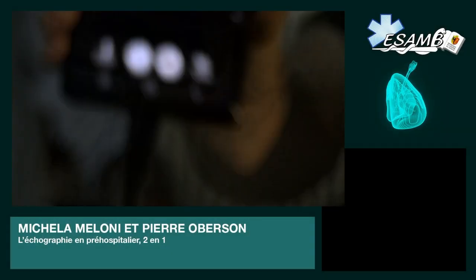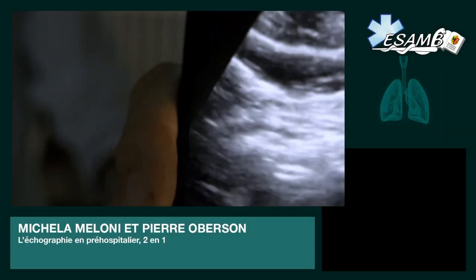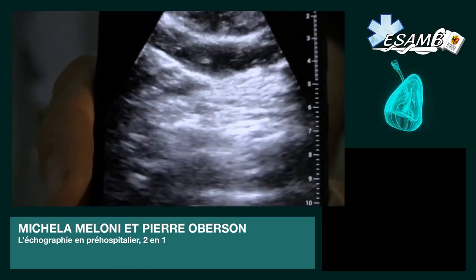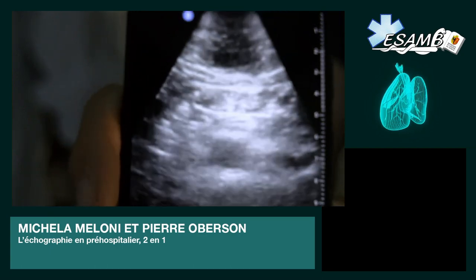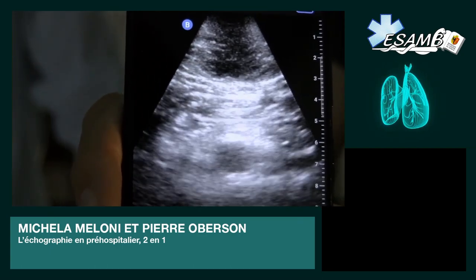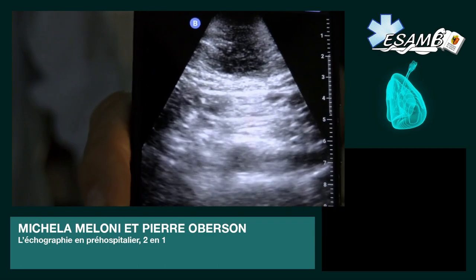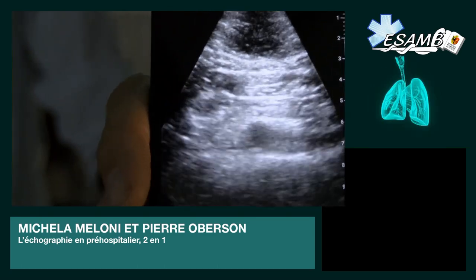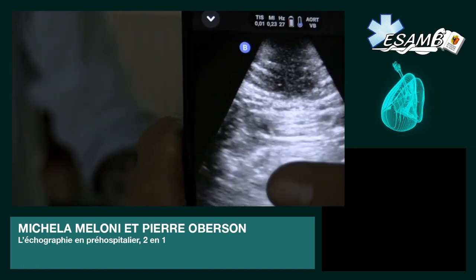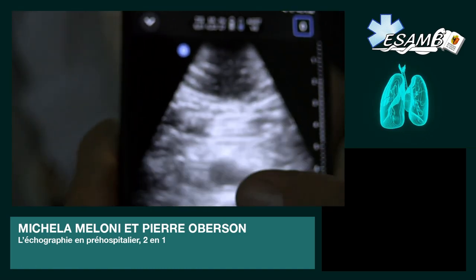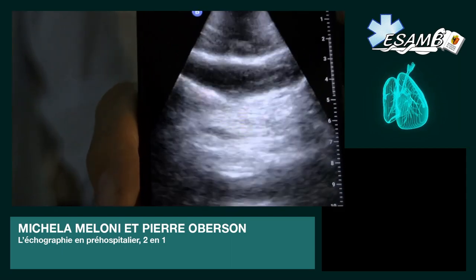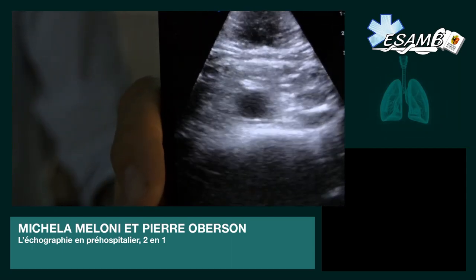Une dernière chose qu'on peut observer, c'est l'aorte de Luc. Il a de la chance, il n'a pas d'anévrisme aortique. On la voit qui pulse au milieu. On voit un petit cercle au milieu un peu plus foncé — là où il y a le doigt qui pulse, c'est l'aorte. On peut vraiment la suivre le long de l'abdomen.